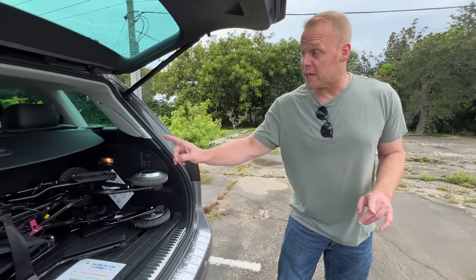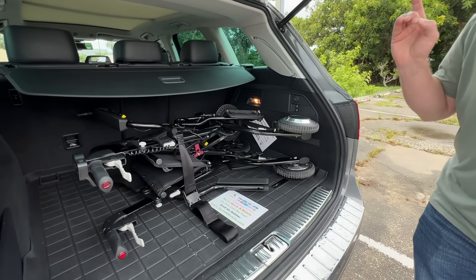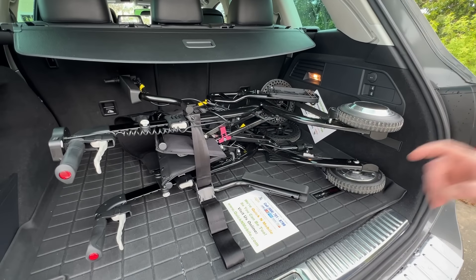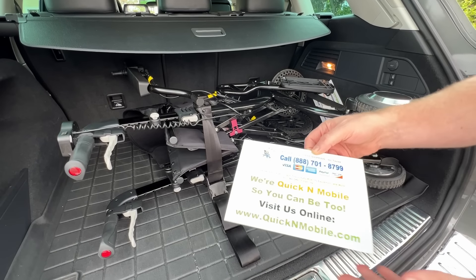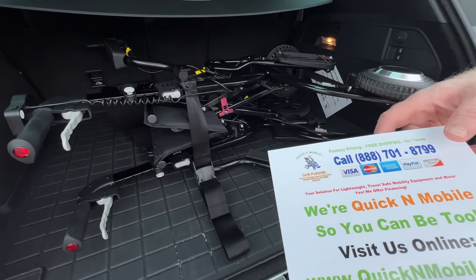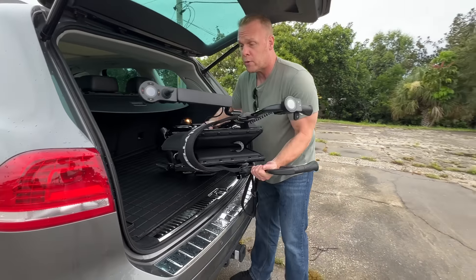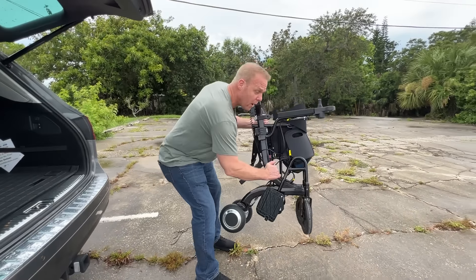Hi, this is Paul from QuickNMobile.com and we are here with the Wheellator, which is a hybrid device. It is a walker that has multiple motorized features and it actually turns into a wheelchair. You can find out more about the Wheellator right on QuickNMobile.com, but let's go ahead and get this 32-pound device out and get it opened up.